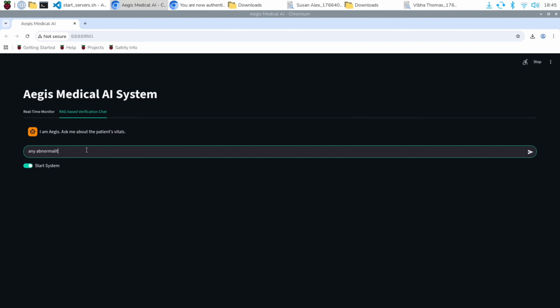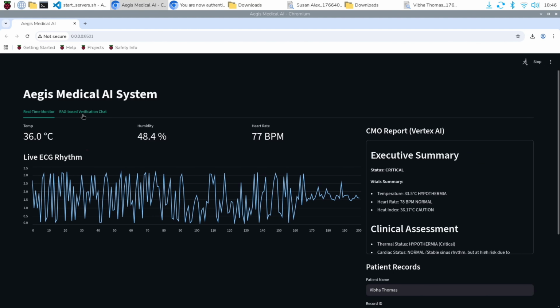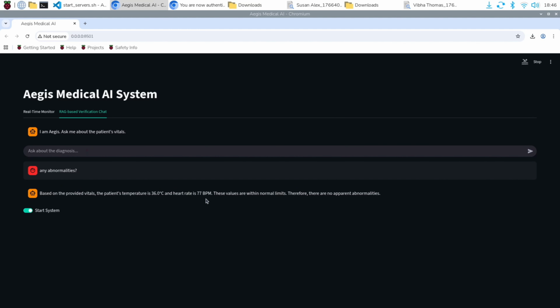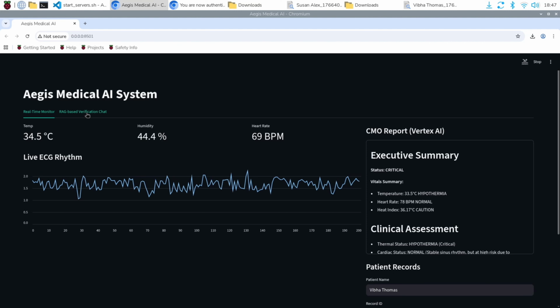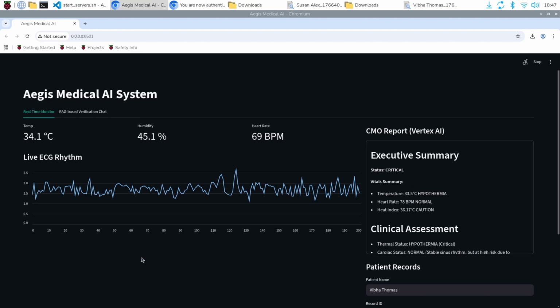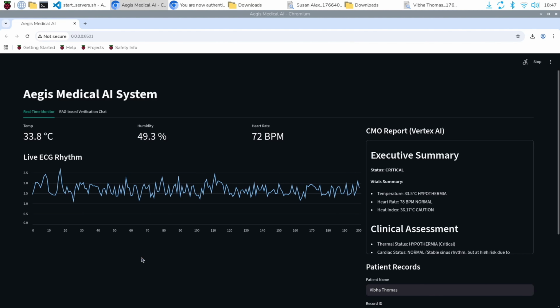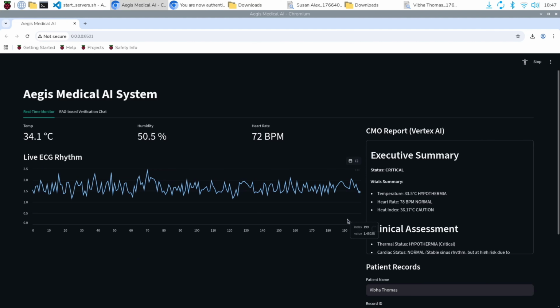Now moving on to the RAG verification implementation that I've made. Based on the data that we're getting, I've asked, are there any abnormalities? And it says the heart rate and the temperature are normal. That's 36.0 and 77.77 beats per minute. So there are no abnormalities. That's because I made sure to simulate a human body temperature using the DHT sensor. So coming back, we tried hypothermia, normal temperature, and let's try a higher temperature.